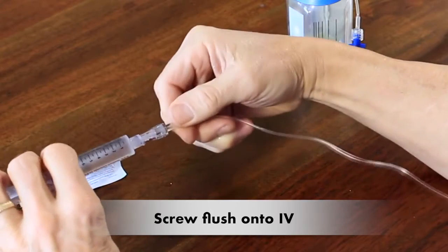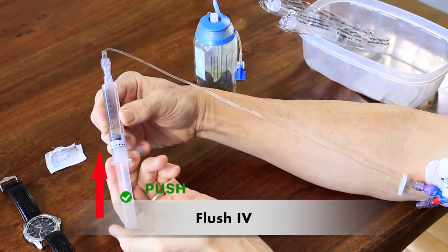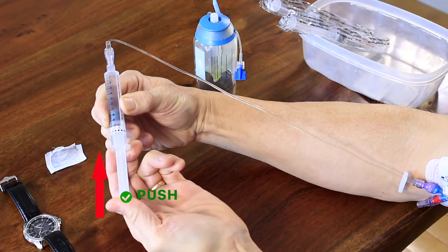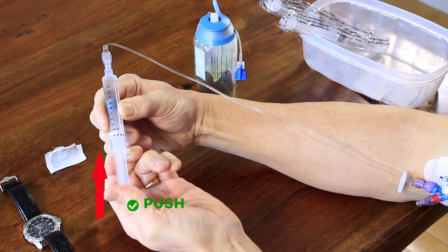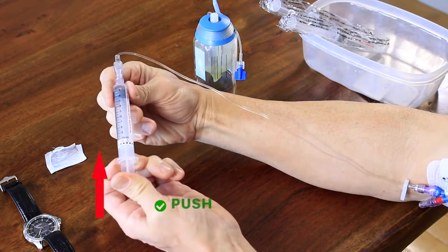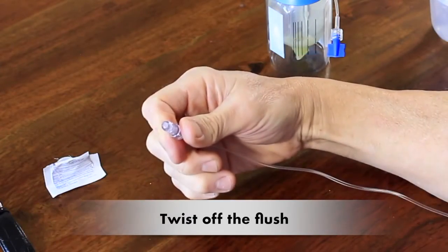And you need to flush your IV. You want to see how easy it is to flush. So you're going to push up on the plunger and stop. Push. Stop. Push. Stop. Push. Stop. Take note of how easy it is to flush, and if it ever gets hard to flush, you'll have to let your nurse know. So now you can twist off the flush and discard that flush.